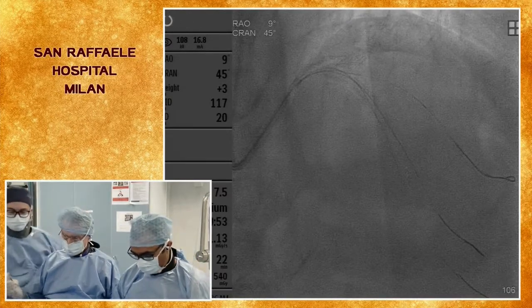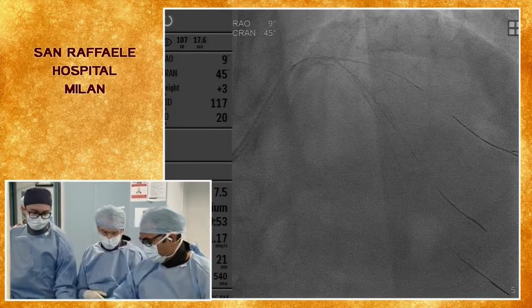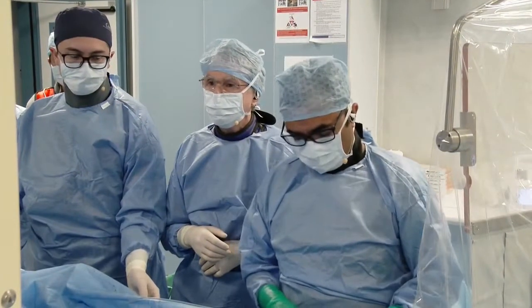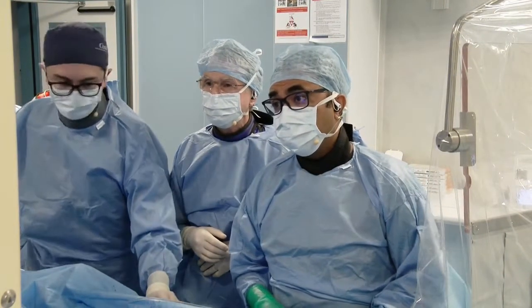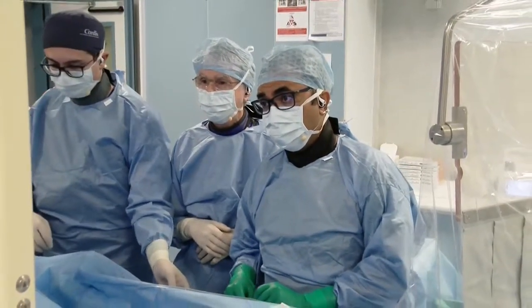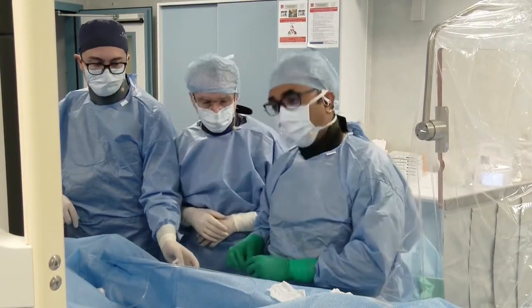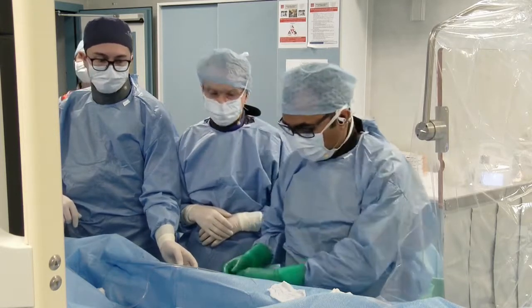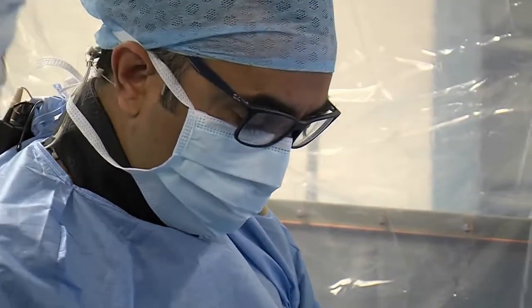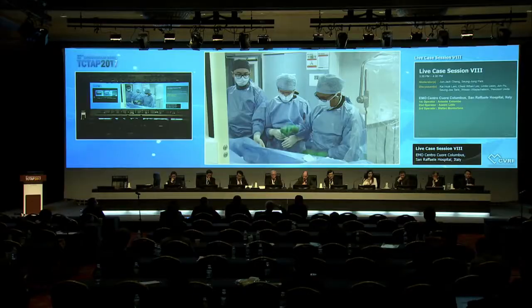Okay. So, now I think we need to rewire the LAD. Some people use the same wire, some people take another wire. I think it depends how tight is the residual lesion now. If it's very tight, it's better to take another wire. If it's moderate, maybe you can. Dr. Colombo, do you think we need to do a POT here, or is it okay? Let's see what we get. You know, with three wires, you're always going to be careful. Yeah, they get entangled.